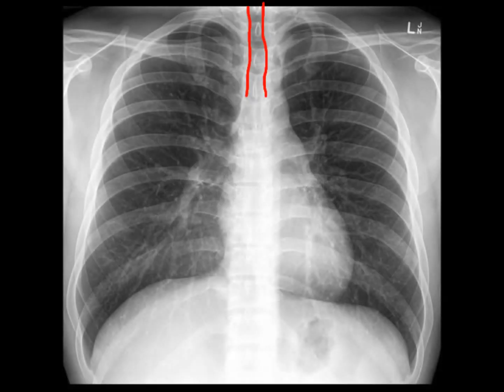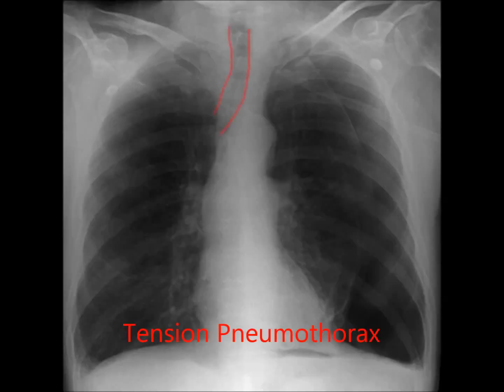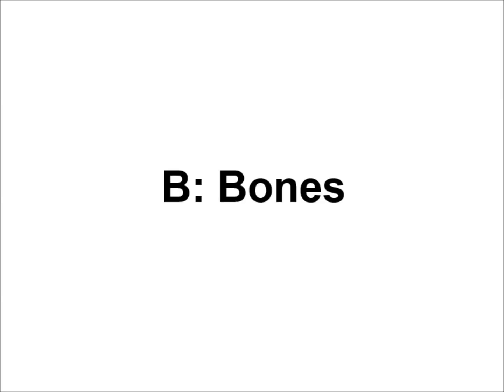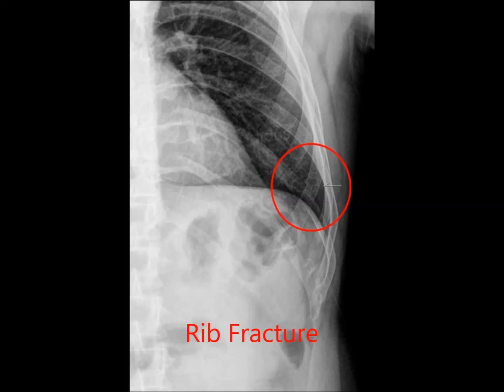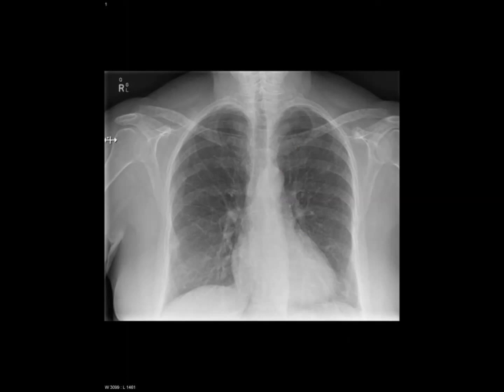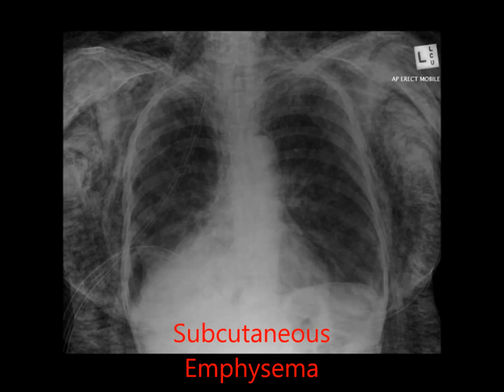A stands for airway. A normal airway is central and open. An airway that deviates to one side may be due to a tension pneumothorax. B stands for bones. Start at the top and work your way down, making sure you look at all the bones visible on the film. The outlines of each bone should have a smooth contour, and a break in the contour could be a subtle indication of a fracture. Also look for any lesions where the bone is more or less dense than it should be, such as the punched-out lesions often seen in multiple myeloma. Also look at the external soft tissue for any abnormalities.